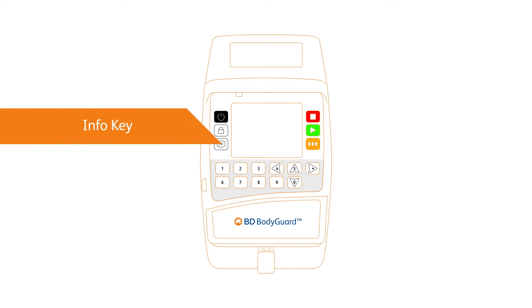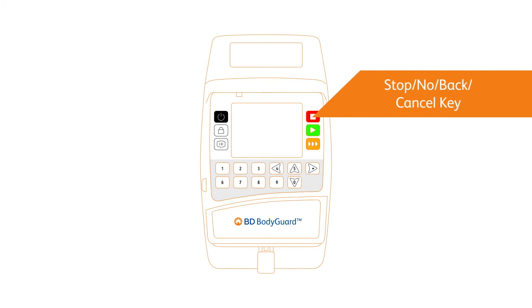The info key supplies additional detail on the pump and its programs. The red stop key pauses infusion, priming, and mutes alarm notifications. When programming infusion, this key clears values and navigates back to previous screens.